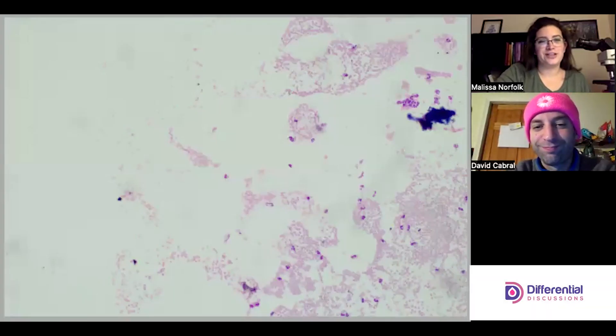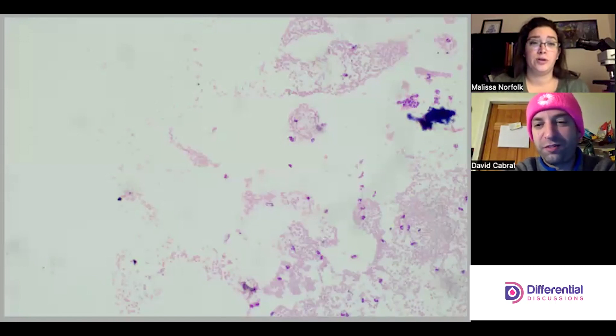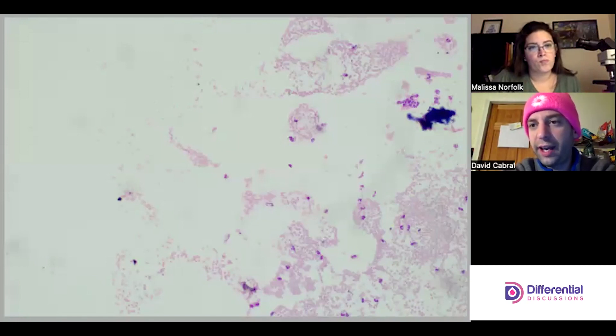Hello and welcome to Differential Discussions, I'm Melissa and I'm Dave. We're going to start looking at our serous fluids, beginning today with a pleural fluid. Dave mentions he's excited about these, noting they're a more consequential category besides CSFs, and points out they have a bloody one.